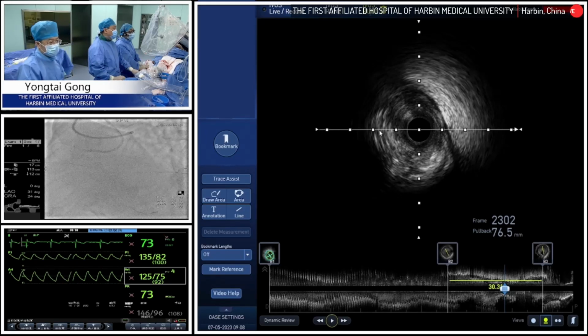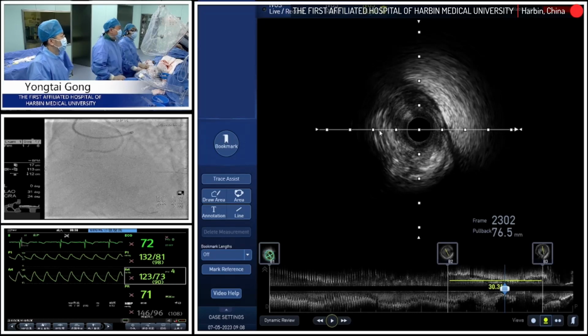So this is what we see from the IVUS pullback, Dr. Gong. Okay, thank you, Professor Chow.